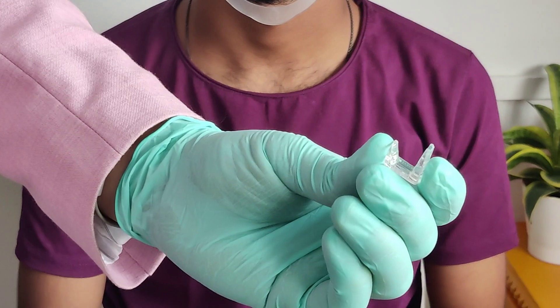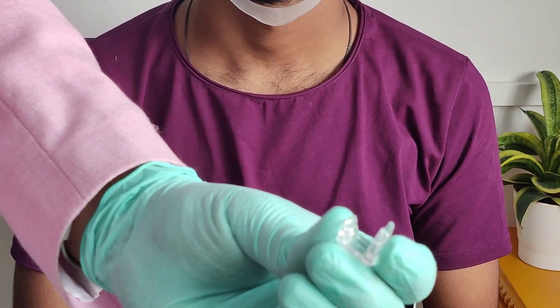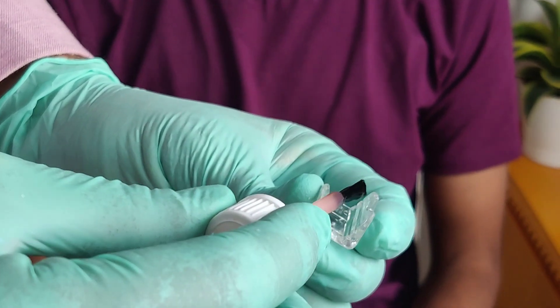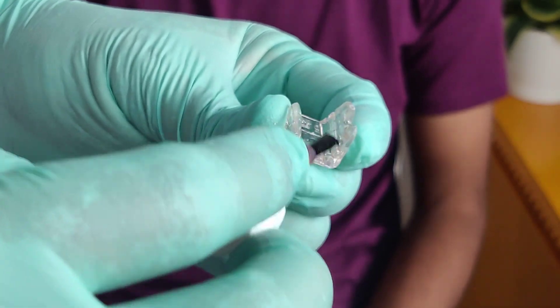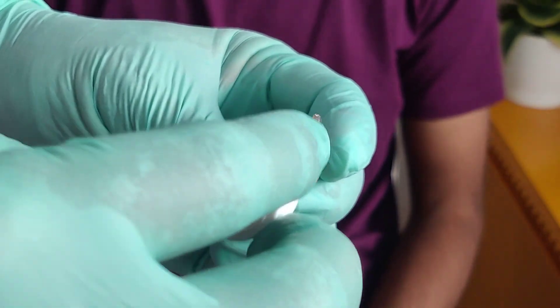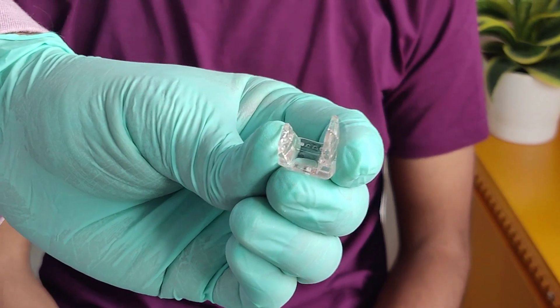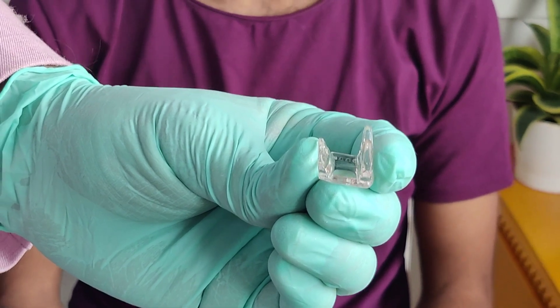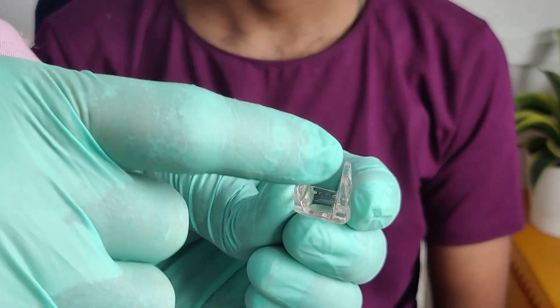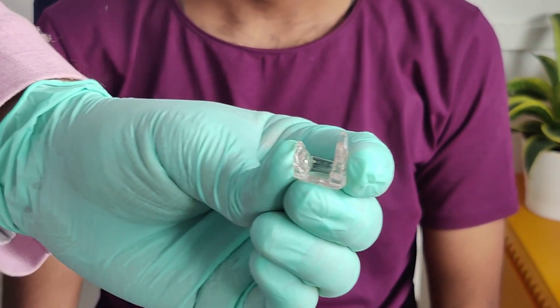This deprogrammer is ready to be relined. Because I am using a bite registration paste, I will first use a tray adhesive and coat the entire internal surface with it. Although there are some mechanical retentive grooves that have been provided, it is very important that we use a tray adhesive if we are using an addition silicone bite registration paste.